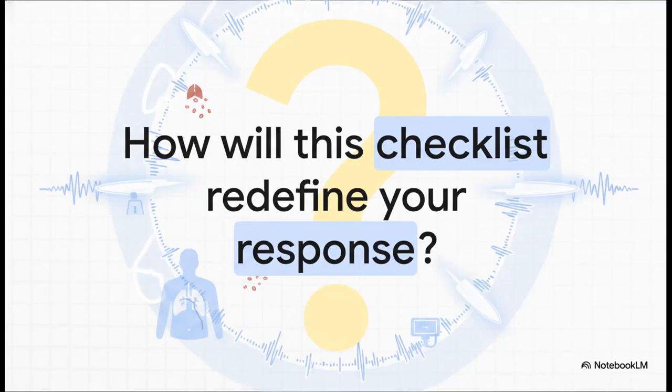As we conclude this explainer, it's pretty incredible to think about how wielding this rapid visual tool cuts right through the chaos of the trauma bay, empowering you to instantly identify life-threatening injuries. It really makes you wonder, doesn't it? How many other chaotic areas of medicine could be completely redefined if we just let sound waves guide the way?